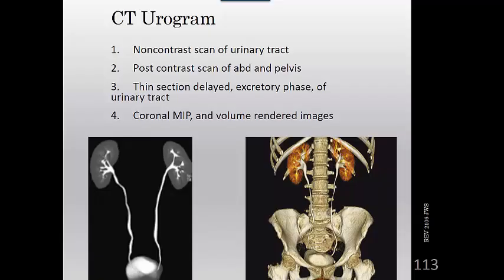So anyway, like an IVP does, and a lot of urologists have different protocols that they want you to do, so you usually have to check with the referring physicians, or you may already have that protocol at your facility, but they can last for a while. You can scan the patient quite a few times. So anyway, the last thing you'll do is some coronal MIPs and volume rendered 3D images of it.